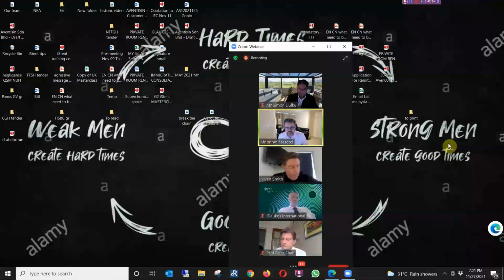So the key thing is do not overinflate the eye with viscoelastic, because you want the head of the stent to be able to get into the canal nice and easily. So there is a balance between how much viscoelastic you put in the eye. You need a sufficient amount to be able to pop the gonio lens on without the cornea flattening and getting striae. But I think you need to be careful how much you put in, because you might have problems with the Schlemm's canal. So that's that one.